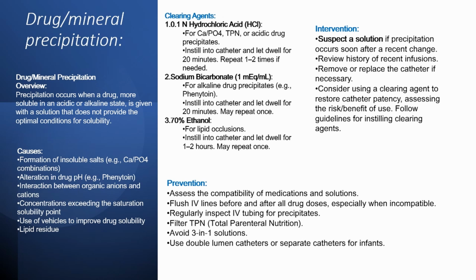Clearing agents. If you suspect precipitation, here are a few agents to help clear the blockage. 0.1 Normal hydrochloric acid for calcium phosphate or acidic drug precipitates. Instill and let dwell for 20 minutes. Repeat if needed.